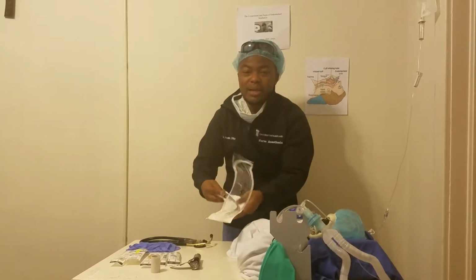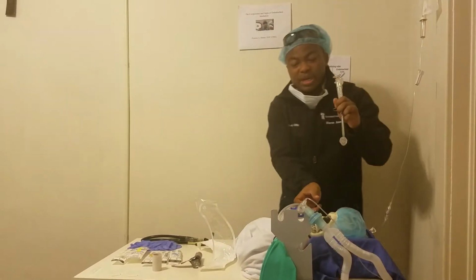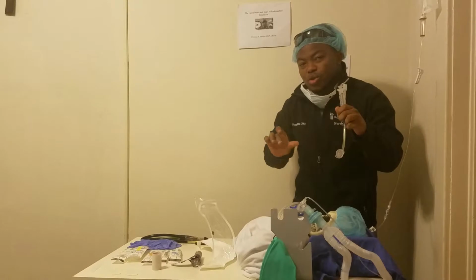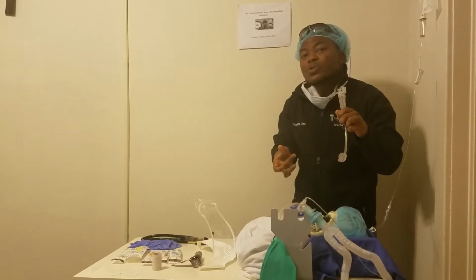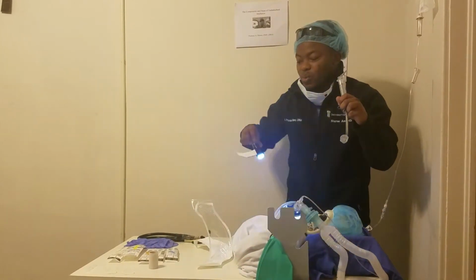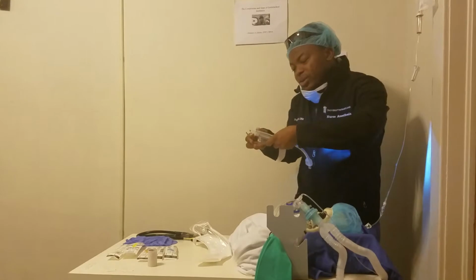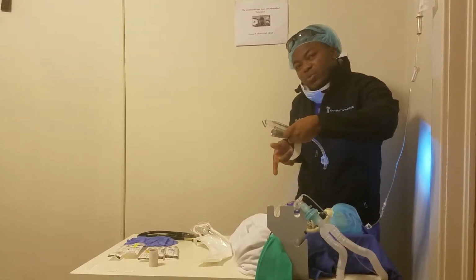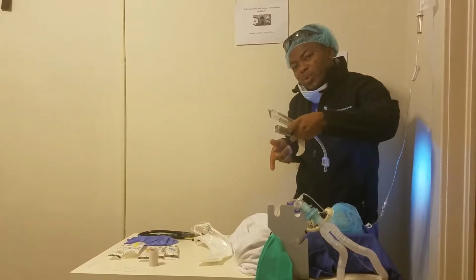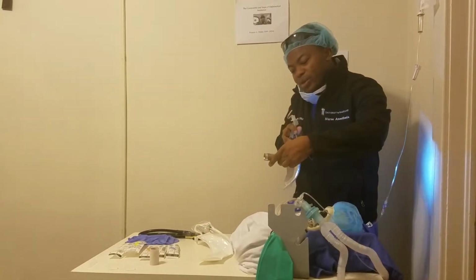We go ahead and take out our endotracheal tube. We scissor the patient's mouth on the right side. So we scissor using our finger, which opens up the patient's mouth. With our laryngoscope blade, we go ahead and sweep the tongue to the side using our left hand, scissors with the right hand, tongue is swept with the left hand, and then we place the endotracheal tube with our right hand into the patient's mouth.